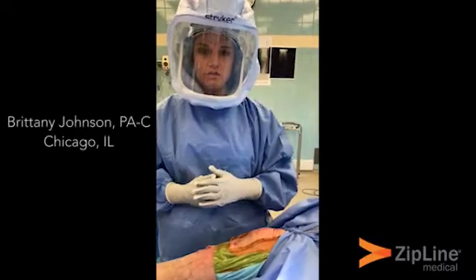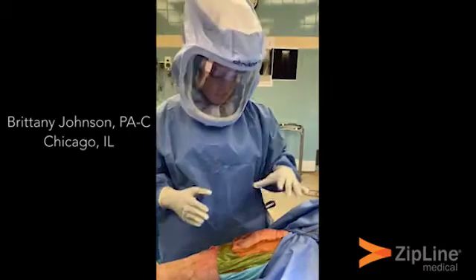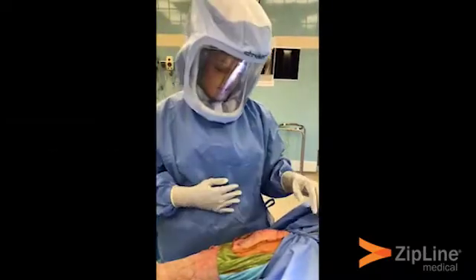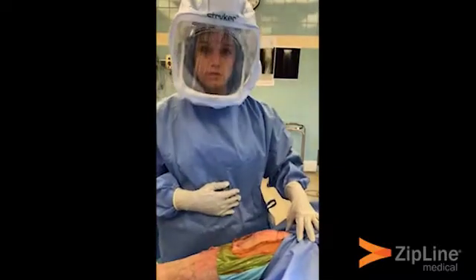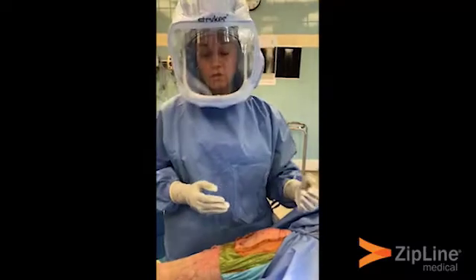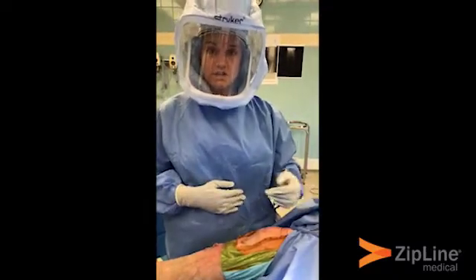The purpose of this video is to show the application of the Zipline enclosure system and to show how it stays on in max flexion. One of the main concerns about using the product is whether it works and stays on in high tension areas such as max flexion during knee replacement.